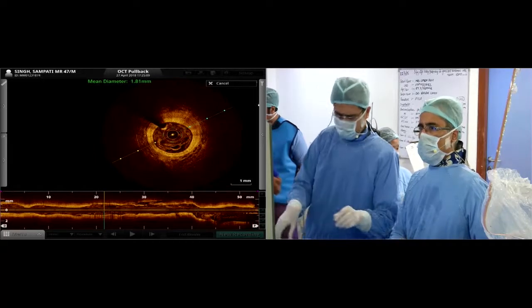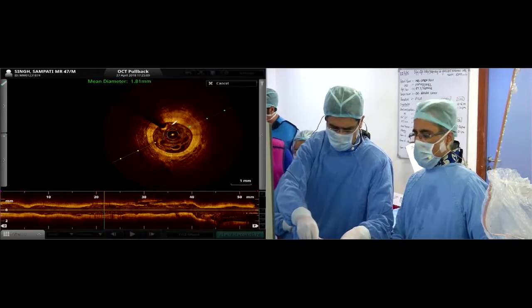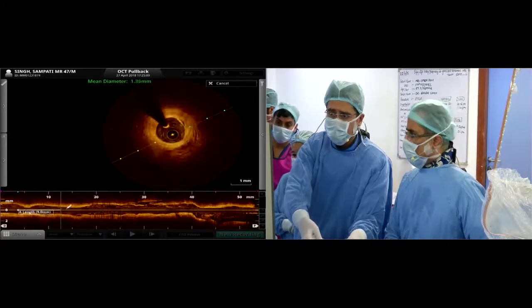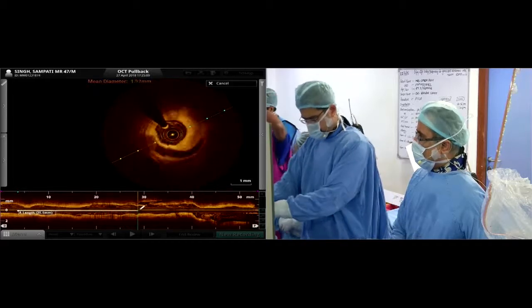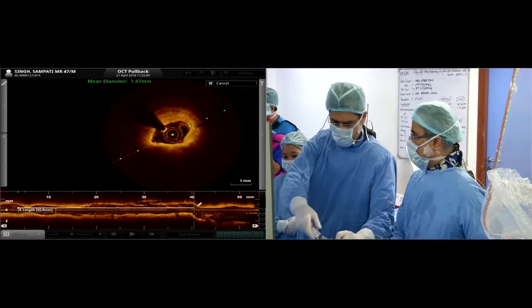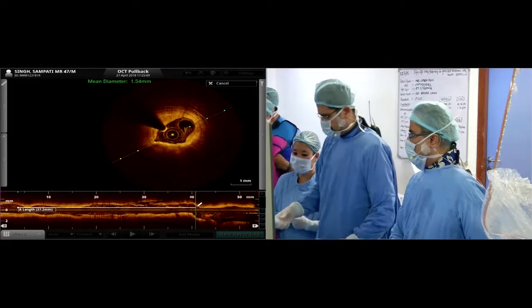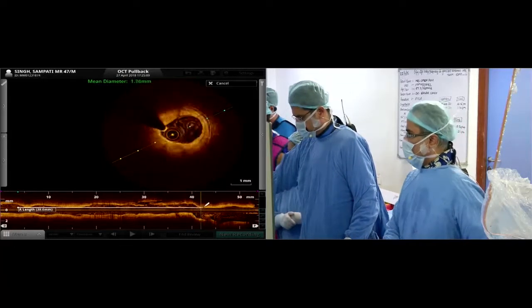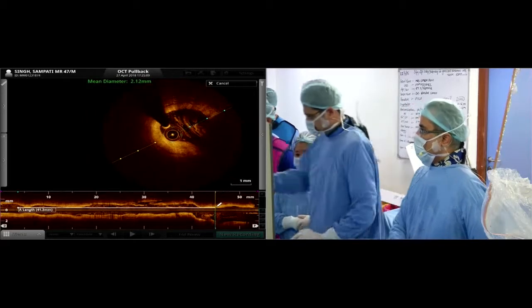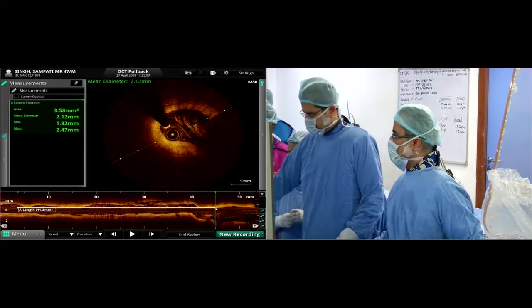Are we inside the left main? Are you measuring now the length of the total LAD disease segment? Yes. How much? It may be more, it seems. So the length of the mid LAD lesion is around 40, and what's the vessel size?